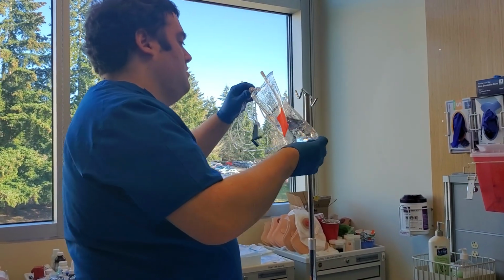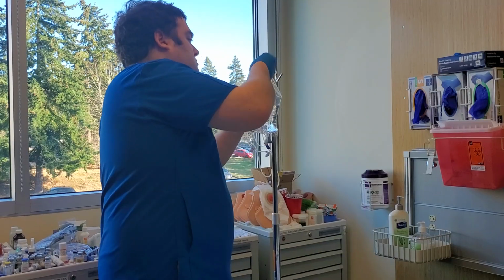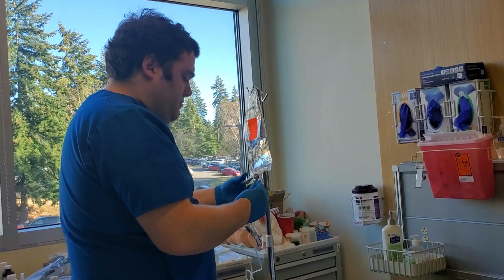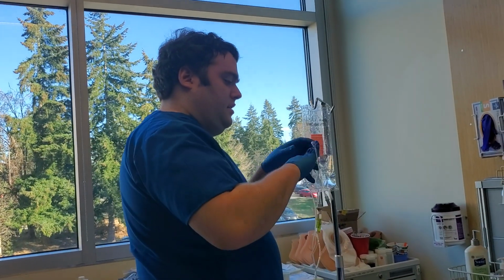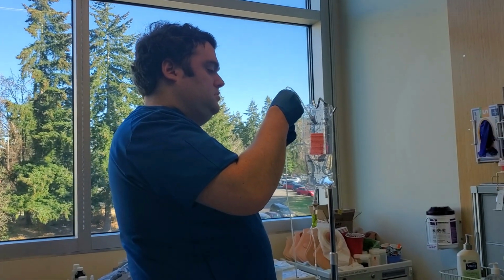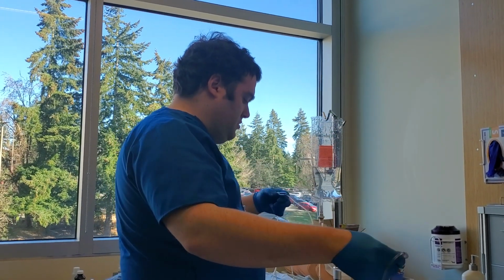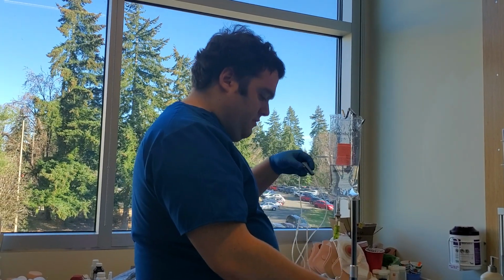Are you feeling any pain? Okay, and then here. So of course we'll also be making sure that I have this roller clamp all set here. And then we've got this all set up.